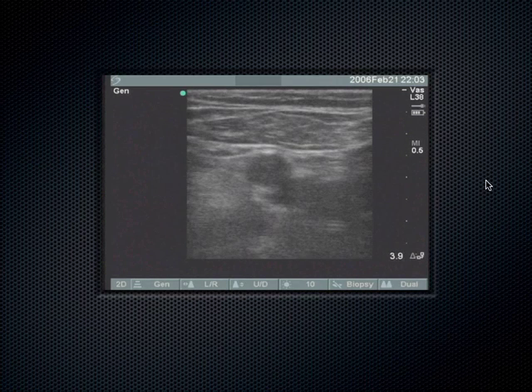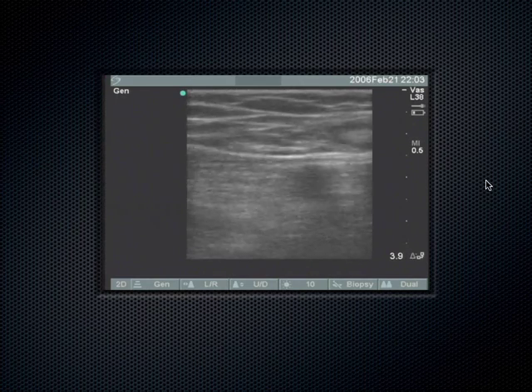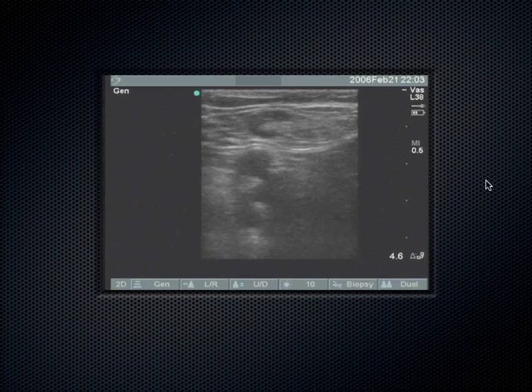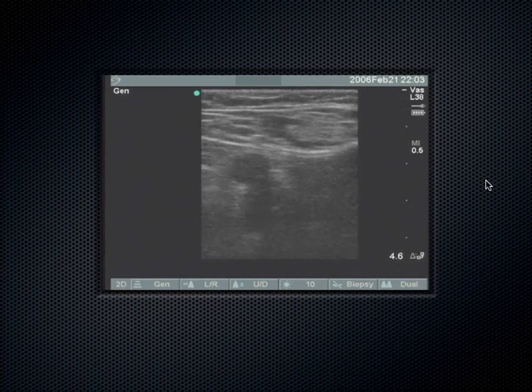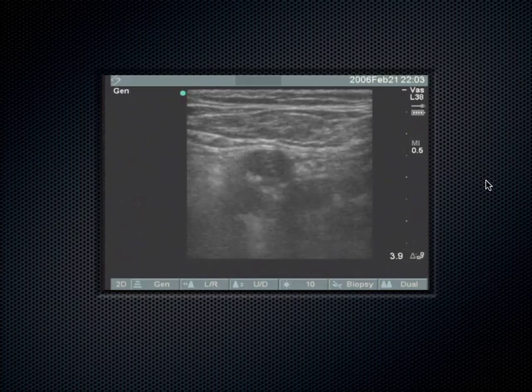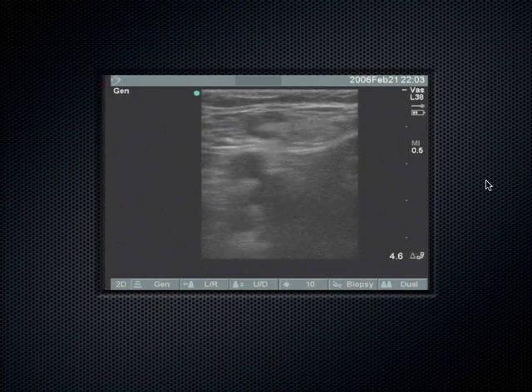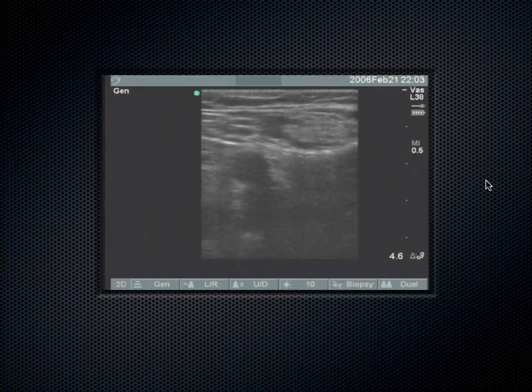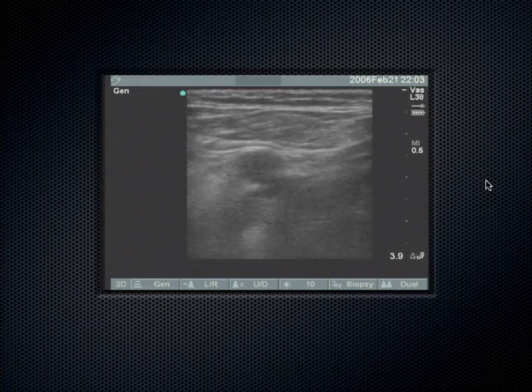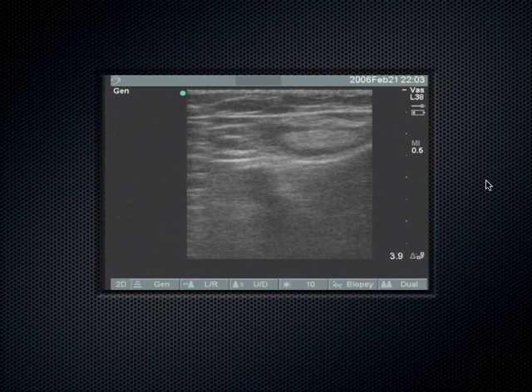But you know what? These patients come in, many times we're struggling clinically between, you know, they've got this red, kind of swollen leg, and you're like, I don't know, is there an infection here? Is this cellulitis? Or is there a blood clot here? And so this is one way to kind of help differentiate that. You look for a DVT, and it's easily compressible, there's no DVT, and then you see that thing up there. What is that thing up there? See, there it is, right there.